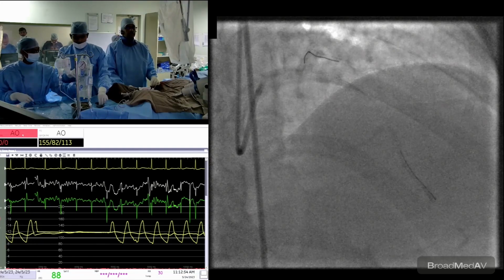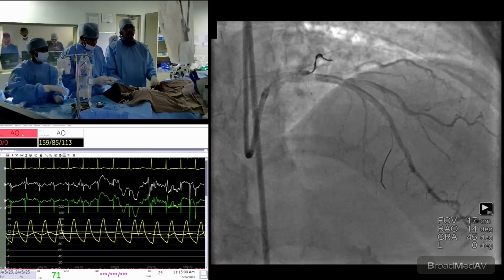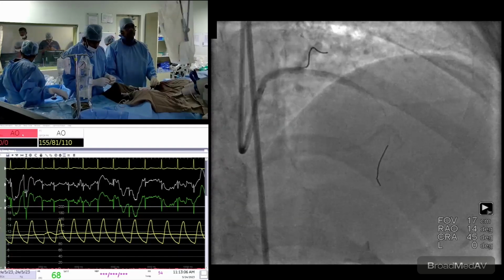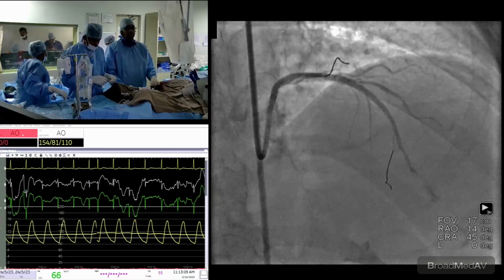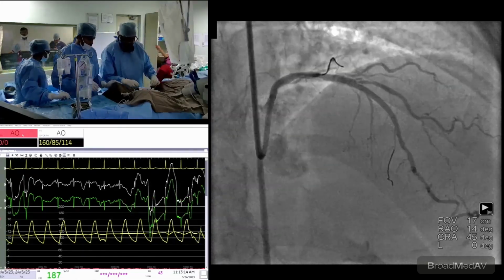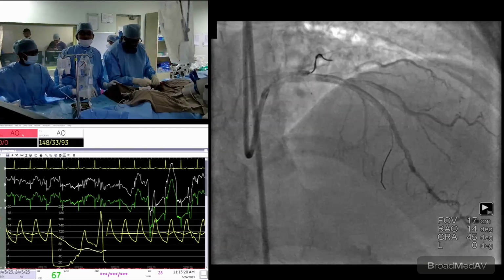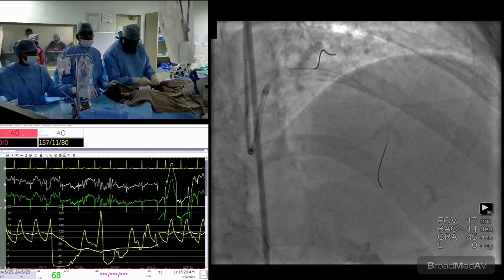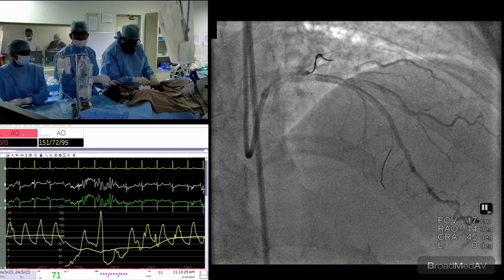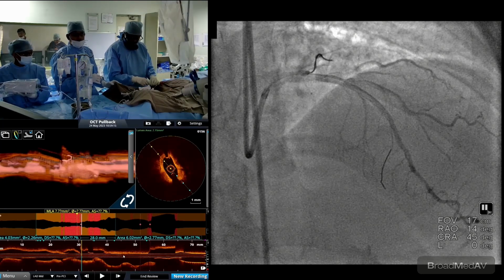Show me the last shot, please, again. Proximal LAD prior to the stent has some disease. We need to decide now what to do for that. No, I don't think so. FFR, if we are going to do it, it's going to be negative. I feel there is disease everywhere, but we chose an ideal landing zone where at least a 180-degree arc of EEM is visible with 3-layer structure in the OCT. So the landing zone is good. So there are blocks in the ostium which is not going to be creating any ischemia for this patient.